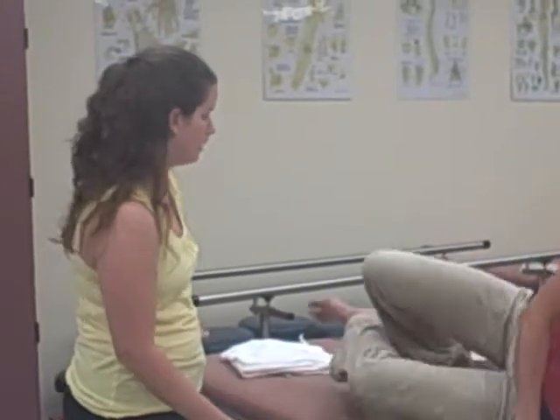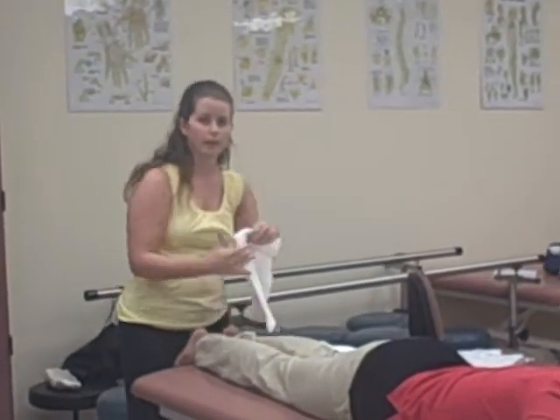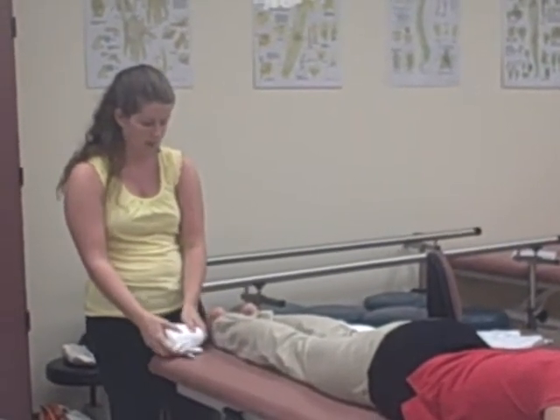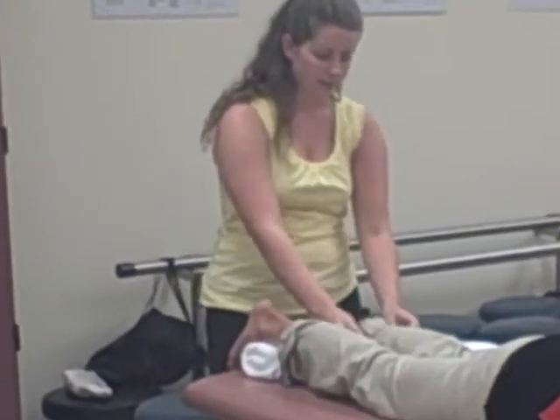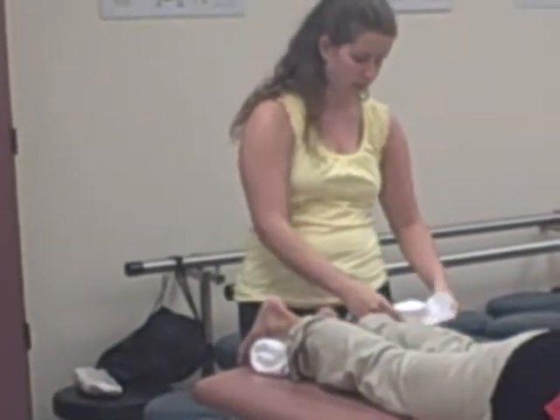And so now that we have seen that she is okay for this, we're going to position her. To get the best use with the ultrasound, you're going to be prone. You can just lie down on that pillow for me. And then we're going to support her ankles. So we're going to roll the towel and pull that up. This is just for comfort for this leg, that way it's up.